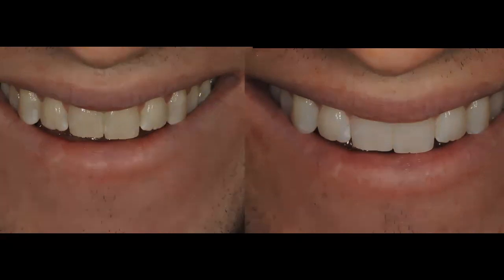But with the progression of the treatment, and that's why you want to use it overnight and you want to use it for maybe 10 to 15 days, you will see that this light shade is going to become more uniform. And you will stop seeing these little spots that the patient is actually being aware of. And again, if you use a non-reservoir tray, it's very easy to have a very thin layer of this bleaching agent in contact with the entire facial aspect of the enamel.